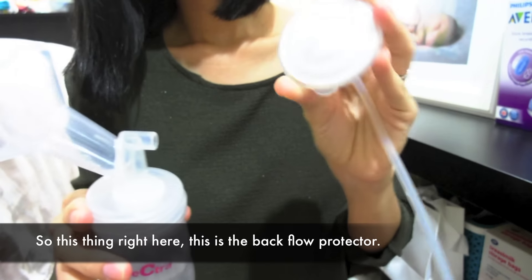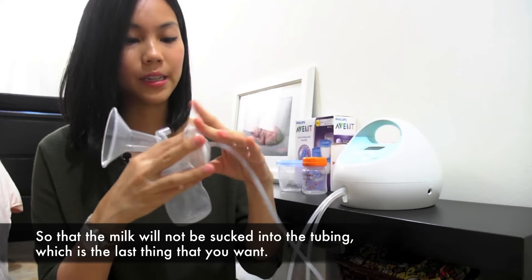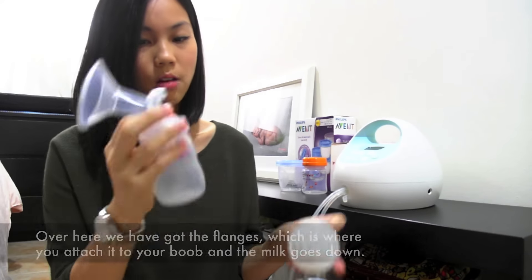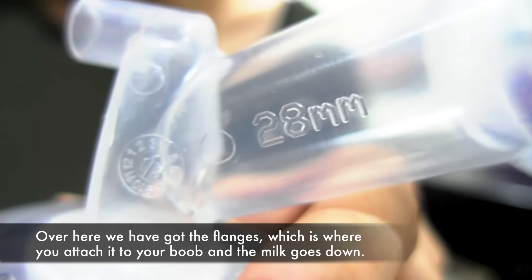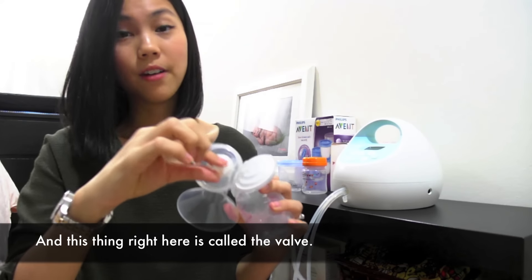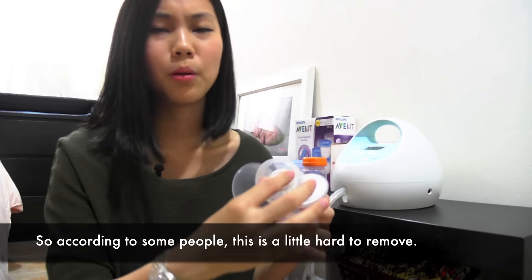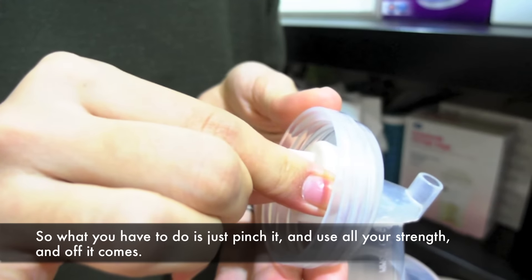This thing right here is the backflow protector, so that the milk will not be sucked into the tubing — which is the last thing that you want. Over here we have got the flanges, which is where you attach it to your breast and the milk goes down. And this thing right here is called the valve. According to some people, this is a little hard to remove, so what you have to do is just pinch it and use all your strength and off it comes.